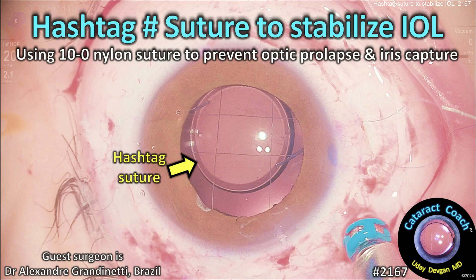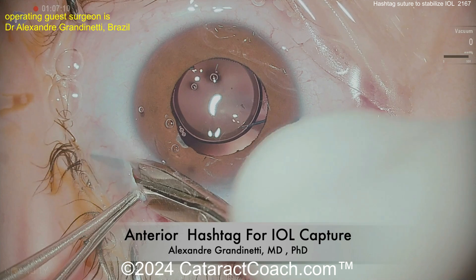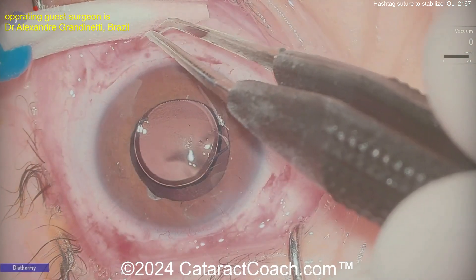CataractCoach.com — the hashtag suture to stabilize an IOL using 10-0 nylon suture to prevent optic prolapse and iris capture. The patient is a young patient with Marfan syndrome who had a pars plana vitrectomy and a Yamane IOL already placed — you can see it's nicely centered and looks pretty good.